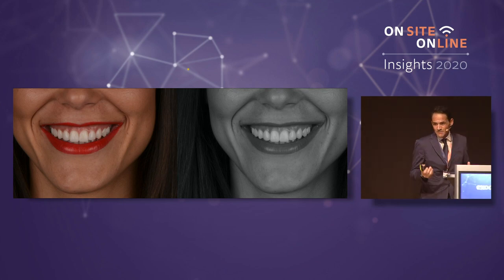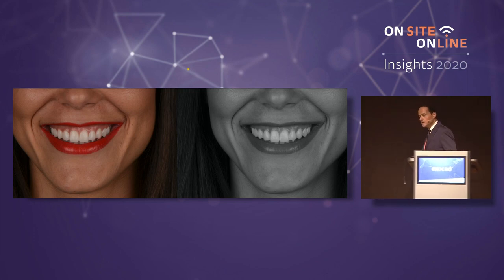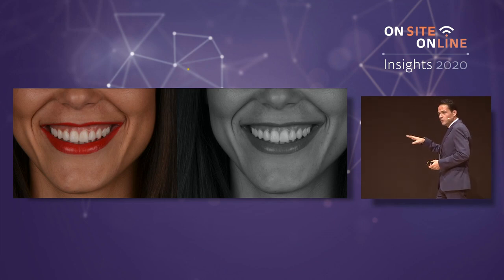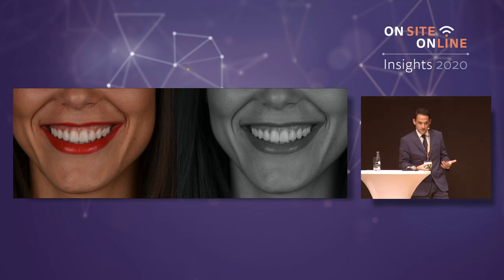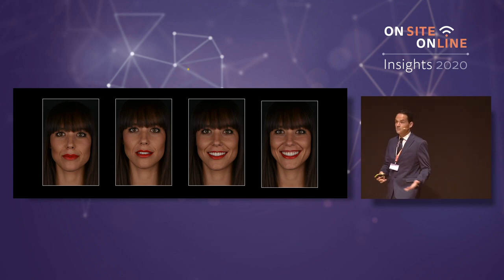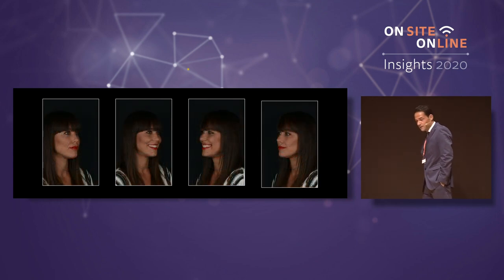So the doctor sometimes prepares these mock-ups, starts polishing it, adapting it, you can cement it. And the patient can go home with the mock-up in her mouth to talk with her husband, with the family, and to accept it. Yes, I want that. So this is the result of the mock-up. The patient has not prepared the teeth yet. Just it is an indirect mock-up. I think it is something you must think and start using in your daily work.